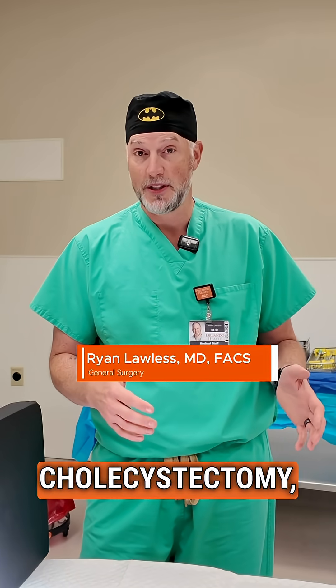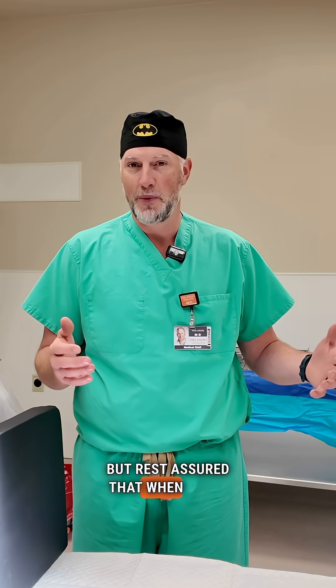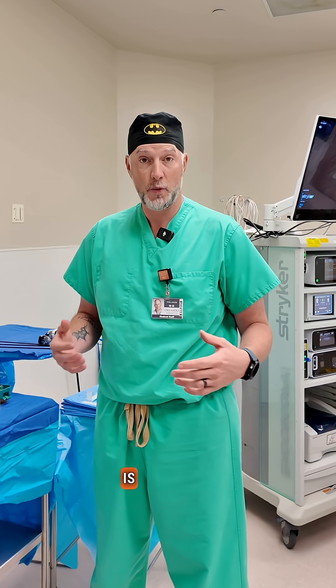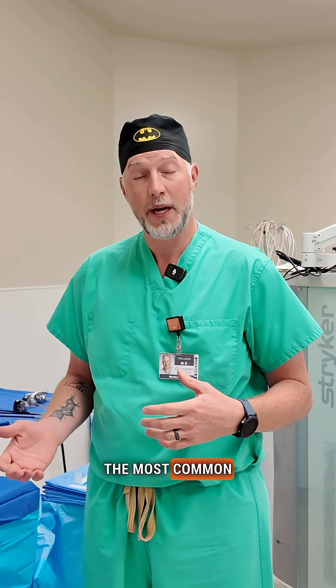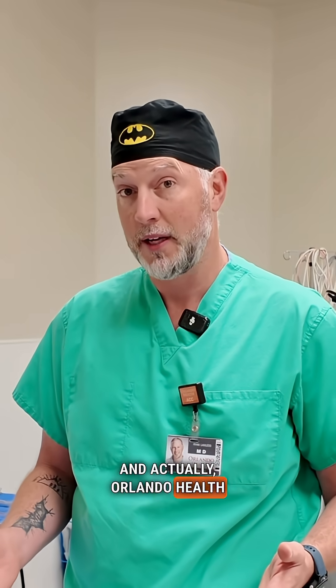I'm going to take you through a laparoscopic cholecystectomy, which is the removal of the gallbladder. This is just a mock, but rest assured that when we do this for real, this is all sterile. Laparoscopic cholecystectomy is one of the most common operations that I perform, and one of the most common operations we perform at Orlando Regional Medical Center, and actually Orlando Health on the whole.